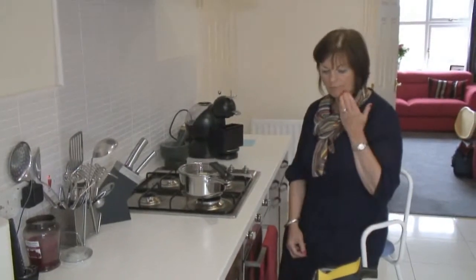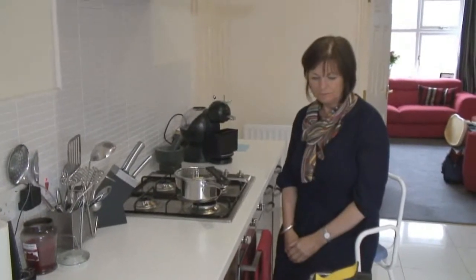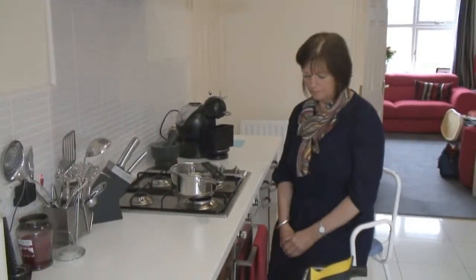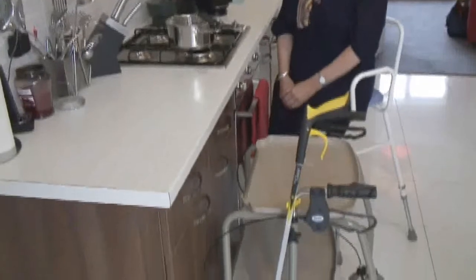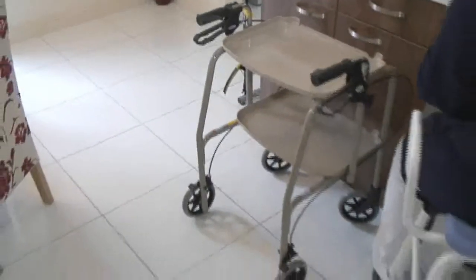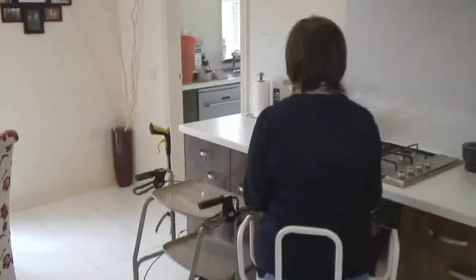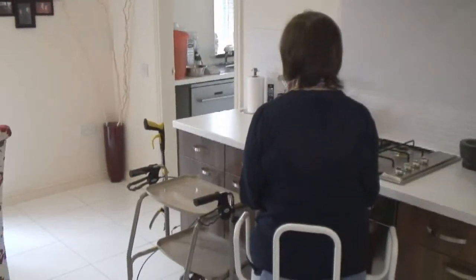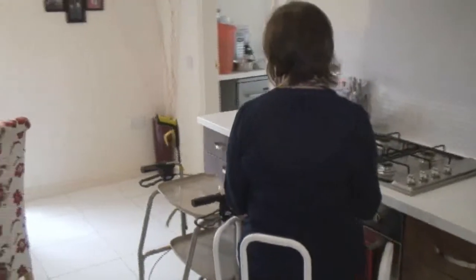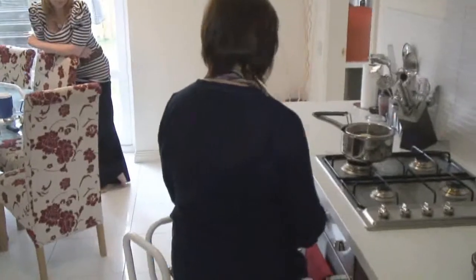There are several uses for the trolley in the kitchen. It can be used for taking hot items out of the oven and putting them onto there, again to move them to whichever surface they need to be on. You can use it for loading and unloading the dishwasher, taking pans across to your sink if you need to wash them, or even for taking things like washing out of your washing machine. That just allows you to wheel things around the home rather than carrying them.